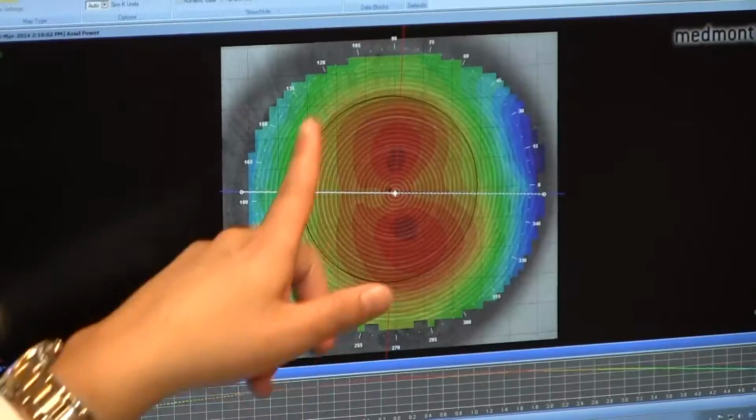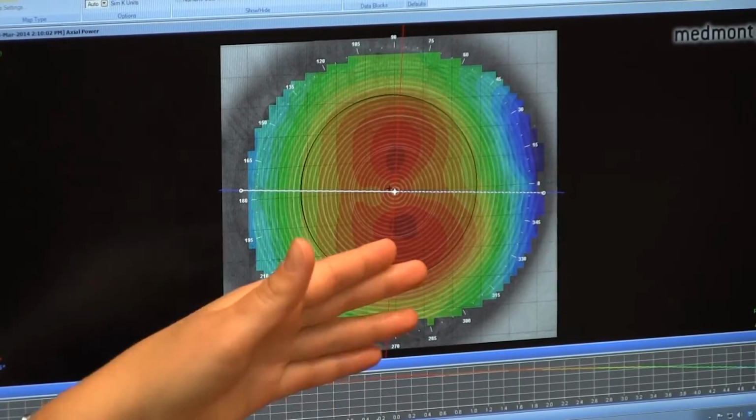When designing the Expert Progressive GP multifocal lenses, one of the measurements that we'll take into account is the corneal size, also known as the horizontal visible iris diameter. When measuring this, we often use a PD rule, or many times a topographer measures the corneal size.